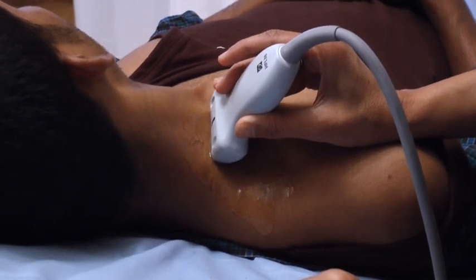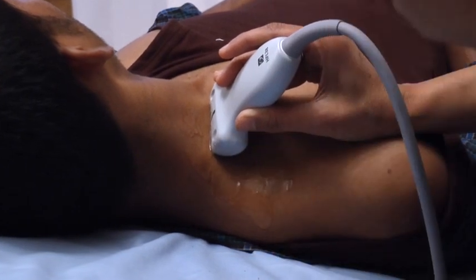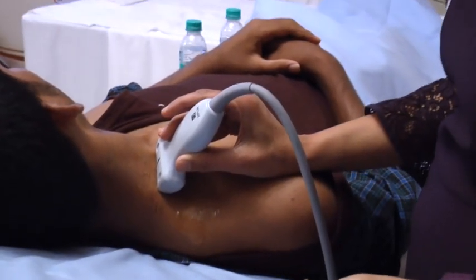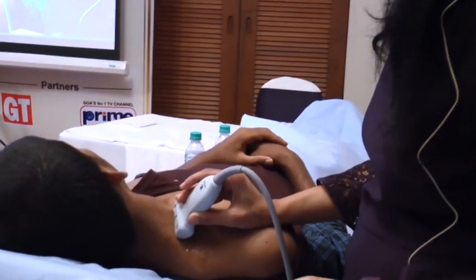I usually do the blocks with patients awake, as we discussed earlier, so do not inject if you encounter high pressures. If your patient is awake and if you're intraneural, they're going to have severe pain, and they will not let you inject into the nerve bundle.